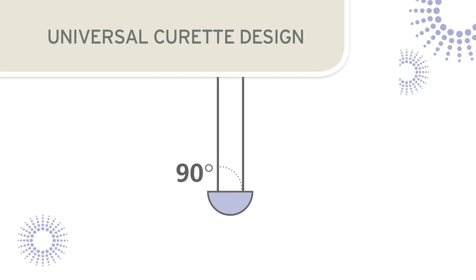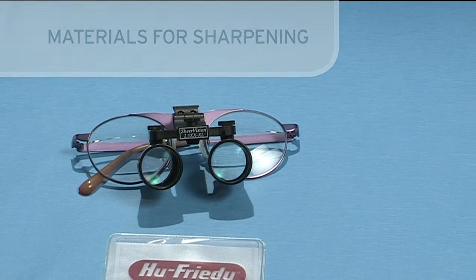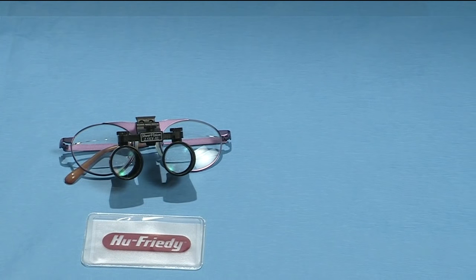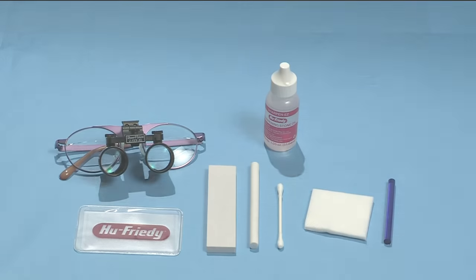When sharpening the universal curette, the cutting edges will be restored by grinding the stone against the lateral surfaces of the blade. Before beginning the sharpening process, assemble the required materials: a sturdy flat work surface with proper lighting, loops or magnifying lens, a flat sharpening stone, a cylindrical stone, oil or water for lubrication depending on the type of stone, cotton-tipped applicator, gauze, and a plastic test stick.